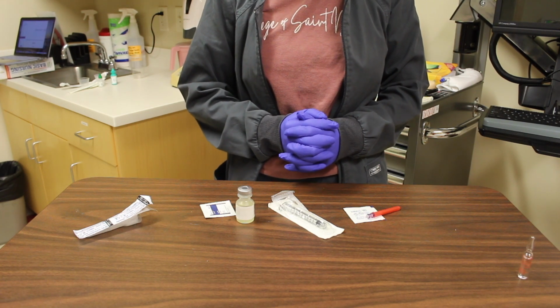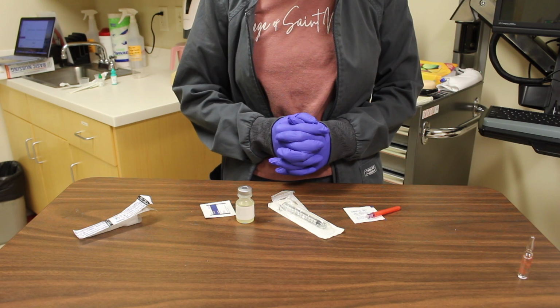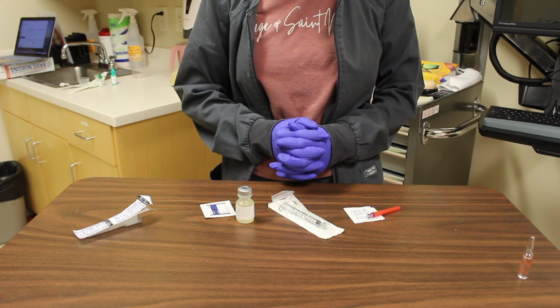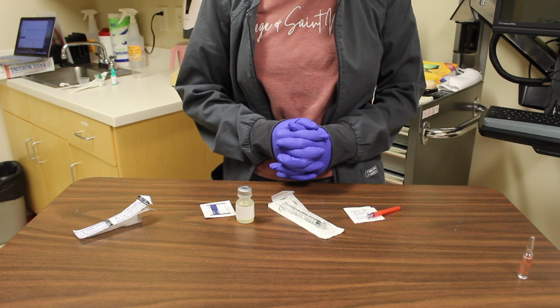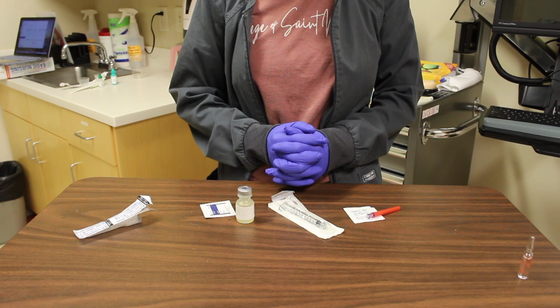This is a skill drawing up medications from vials or ampules. First, complete all of the medication guidelines, including the 3 checks against the MAR, identifying the patient with 2 identifiers, and educating the patient about medications. Complete the 6 essential tasks.